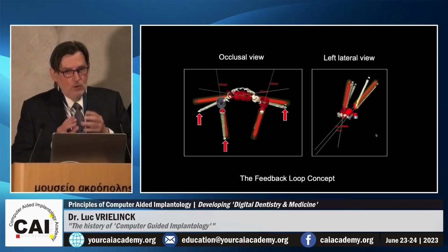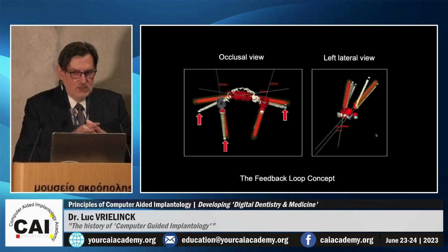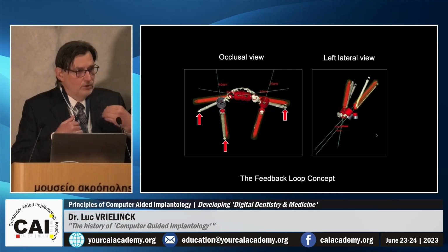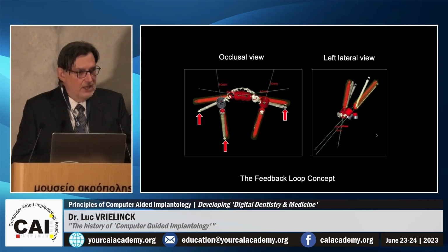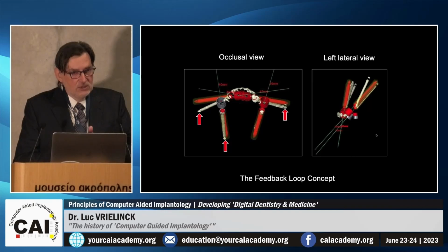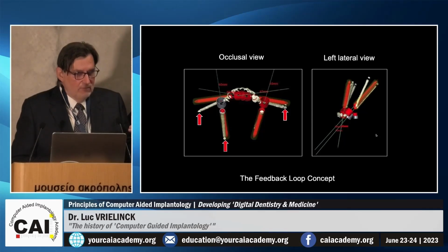It means that going digital allows you to make a feedback loop, because you can do your treatment and project it back on your planning and see what you have done. So this is the learning tool for our own work. How can we improve what we're doing? Here, it taught me a lot: don't do that again. For other things, okay, you're on the good way, continue, maybe you can refine it if you study well the pre and the post-op. So this is, for me, a really, really good advantage of the digital way.